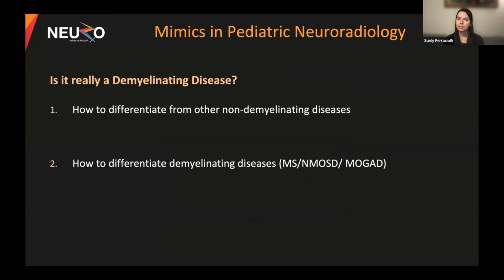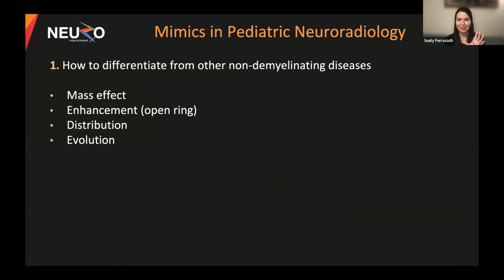So how can we differentiate them from other non-demyelinating diseases? And also how can we differentiate them between themselves, like MS, NMOSD, and also MOGAD, which is our main star here because it may have so many different imaging aspects.